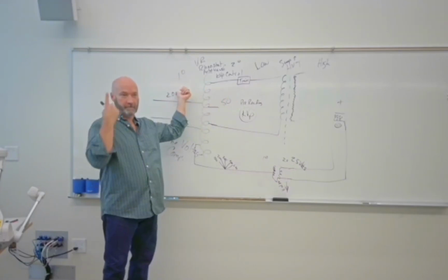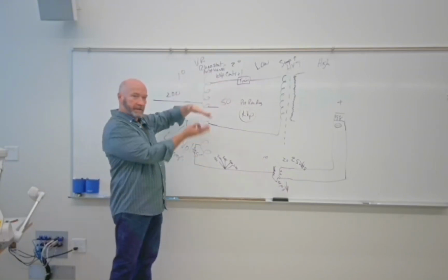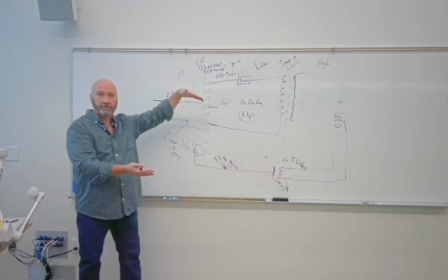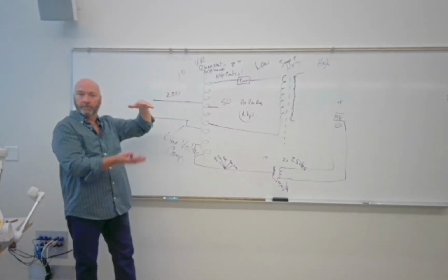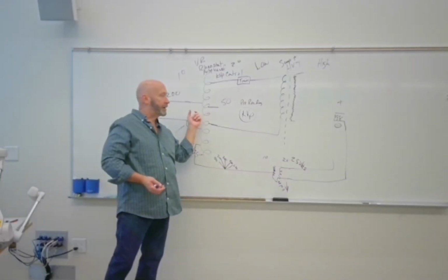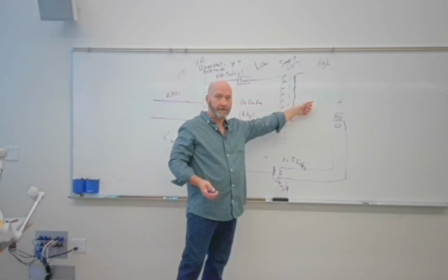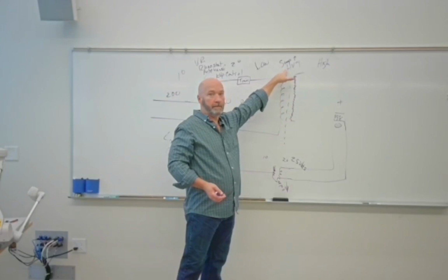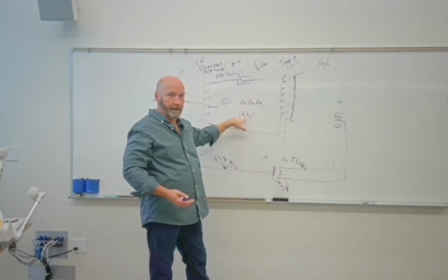This is primary, this is secondary, right? What you're actually doing there is adjusting your voltage. When you spread them out or bring them together, you're adjusting your voltage. We're going to determine how much voltage we're going to get on the secondary side of the step up high voltage transformer by using the KVP meter.